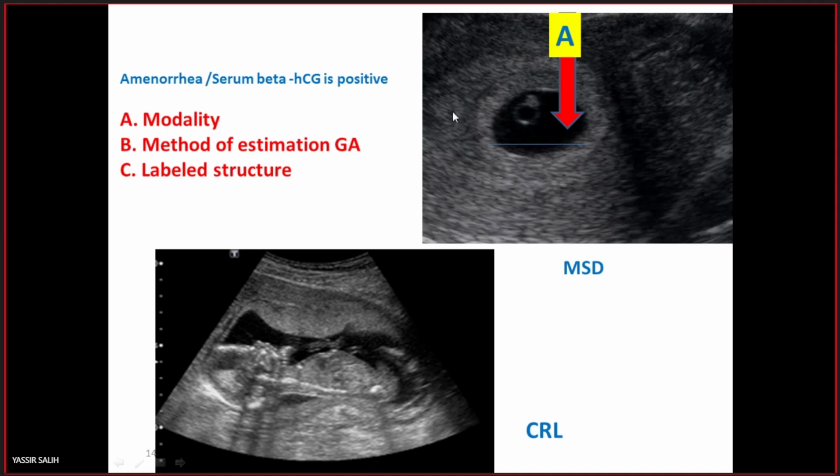Mean sac diameter. Yes, mean sac diameter. What is this structure called? This one. Gestational sac. And what is this?